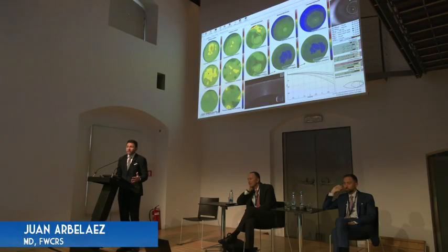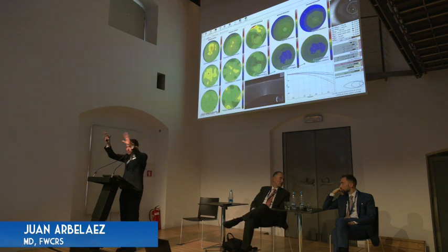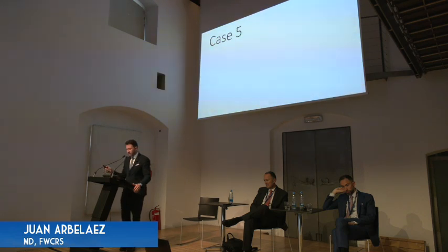In this patient, the epithelium is something that is changing daily. So this patient can come in a follow-up and have now the epithelium absolutely normal. So we need to pay attention to the evaluation of all the maps together. So here I want to show you guys another case, 2 more cases.